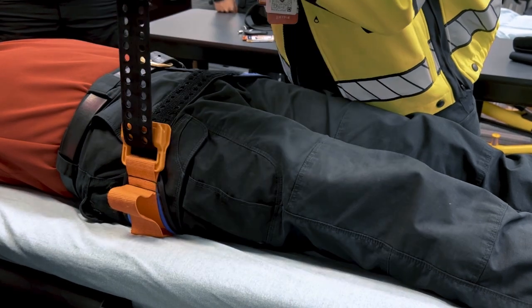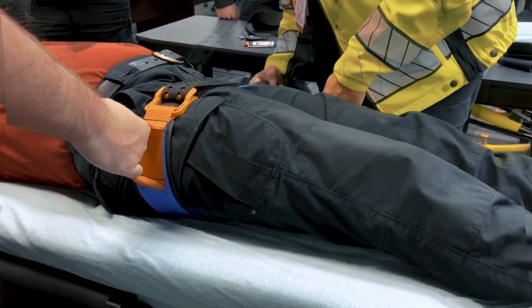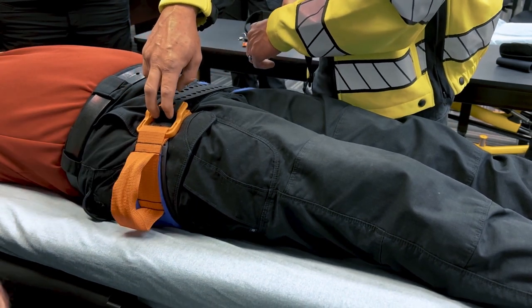Pelvic binders are used to provide rapid circumferential compression and stabilization of the pelvic ring, which can help reduce bleeding, minimize pain, and decrease the risk of further injury.